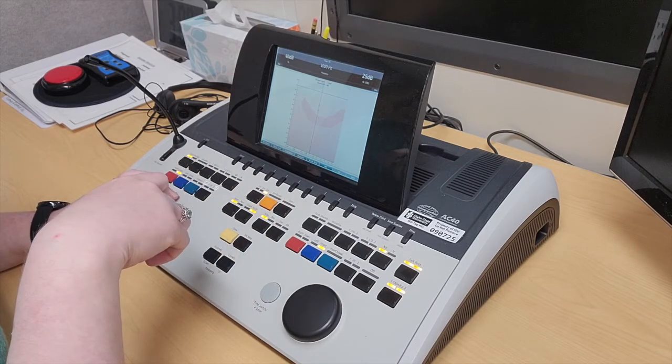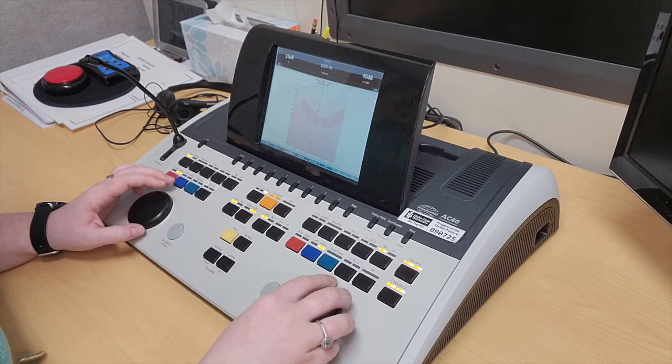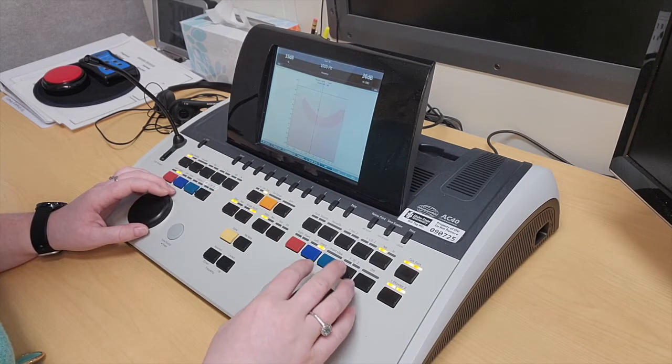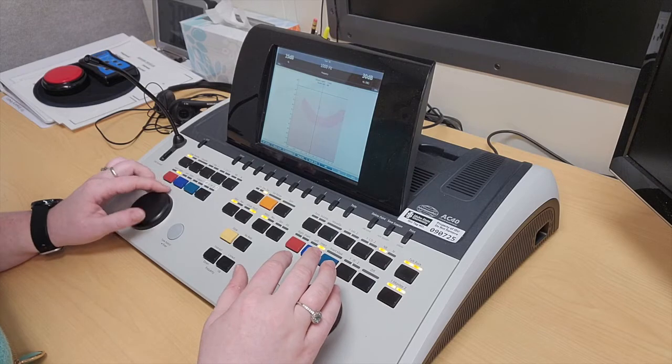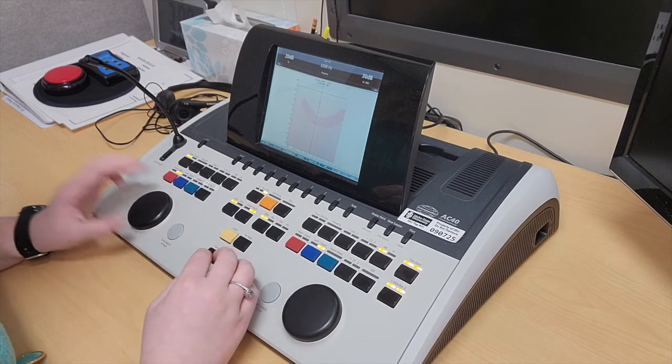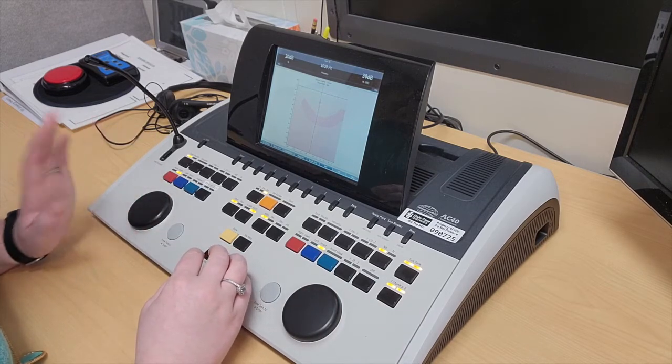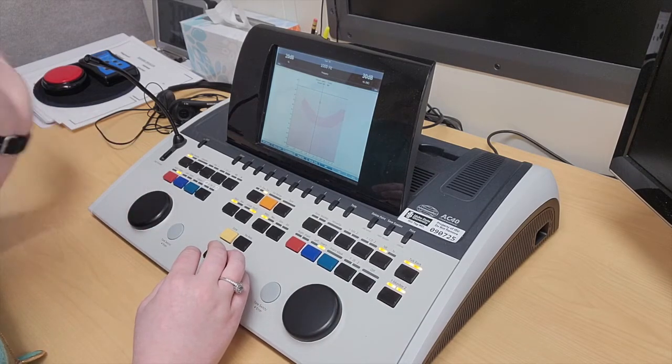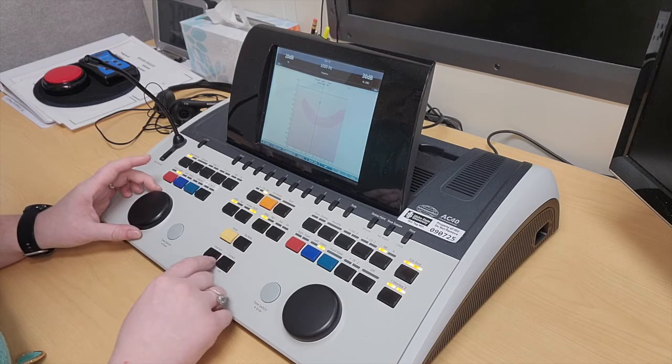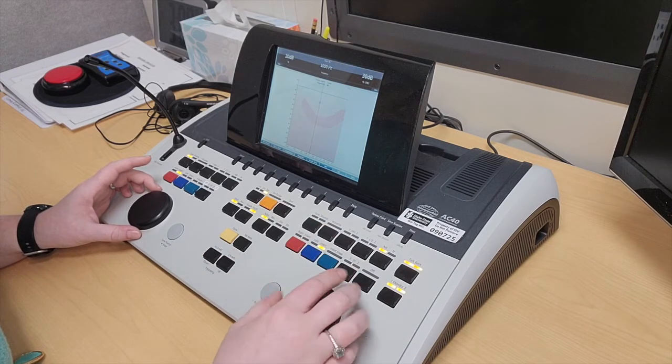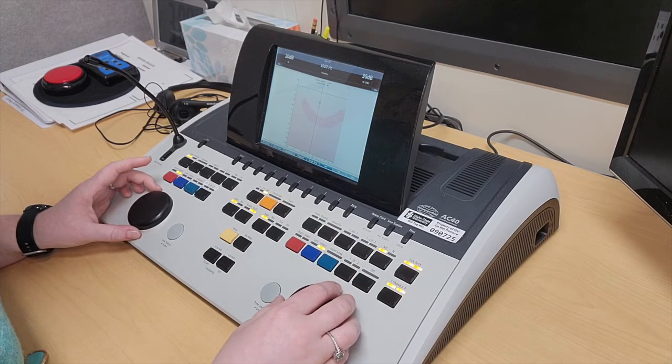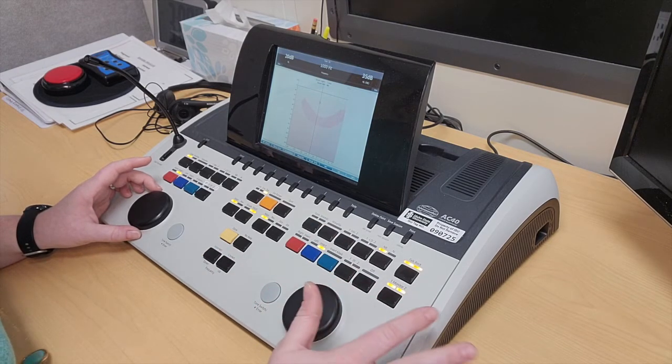If I don't sync them, then I'm doing one at a time on each side. Here, this one on the right is presenting the tone at 20 dB, and then this here I have at 35 dB for the masking.